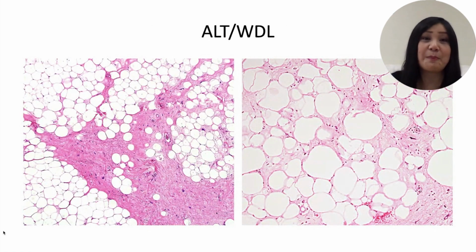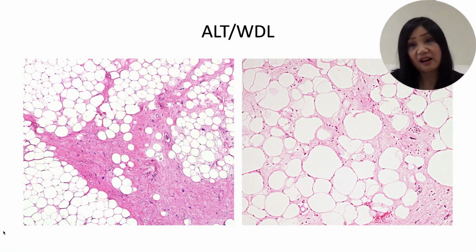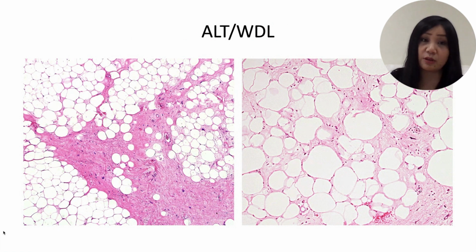And then finally, the most important differential diagnosis for dysplastic lipoma is, of course, atypical lipomatous tumour / well-differentiated liposarcoma. Just to clarify, ALT and well-differentiated liposarcoma refer to the same histologic entity. They are clinical terms assigned to tumours that occur at different sites and therefore have different prognoses. Atypical lipomatous tumour occurs in superficial, essentially surgically amenable sites, while well-differentiated liposarcoma is the same histologic neoplasm but occurs in deeper sites which are harder to excise fully.